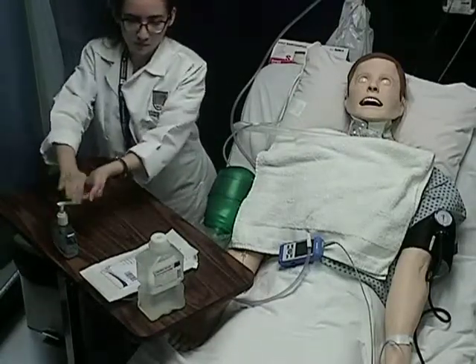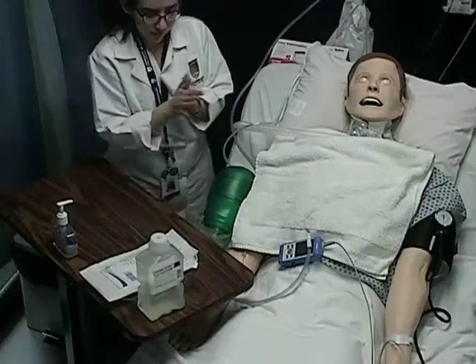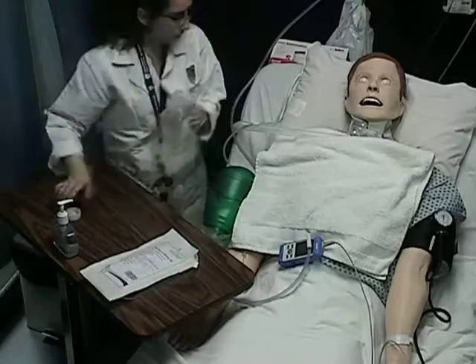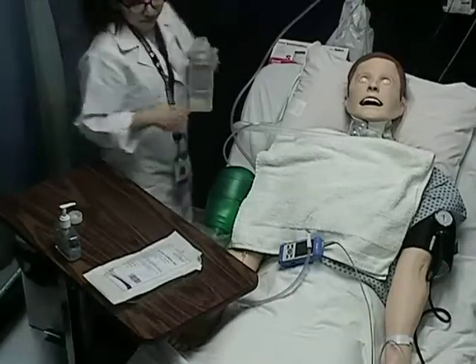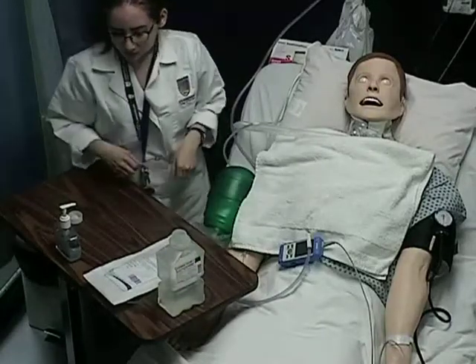Now we may begin the suctioning process. Open the saline bottle, lift the bottle, and then place back on table. Open suction kit.